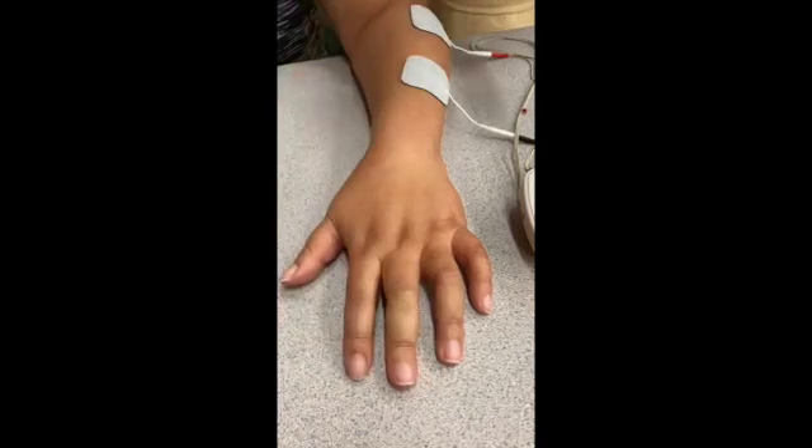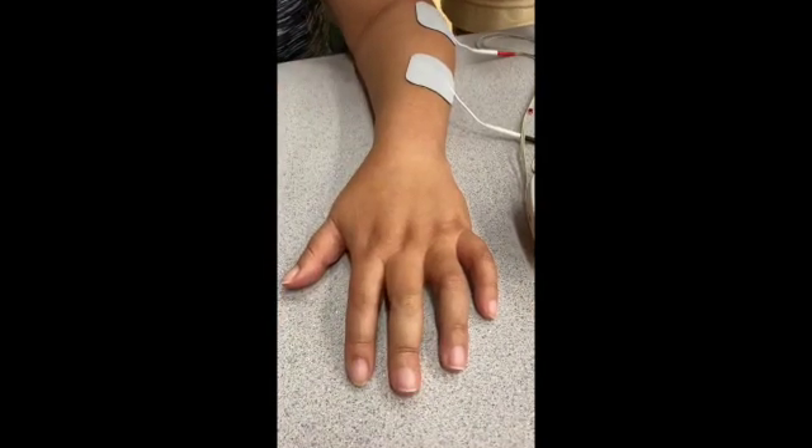When the e-stim turns on, you should see a contraction that will elicit finger extension.